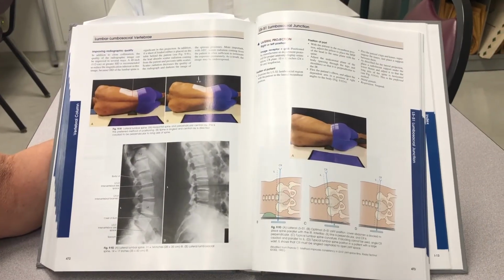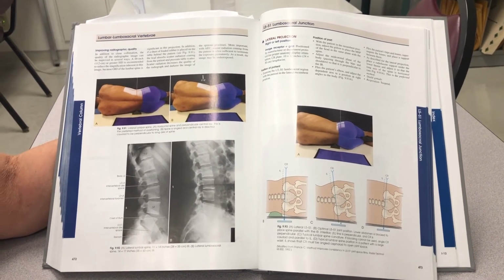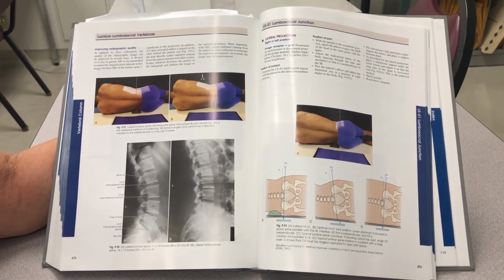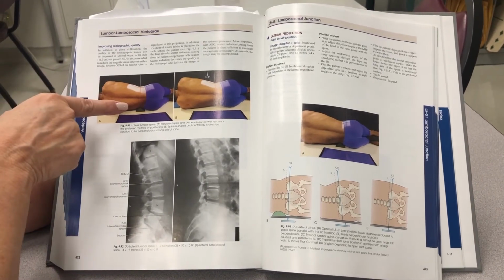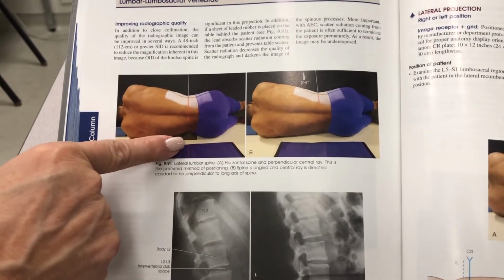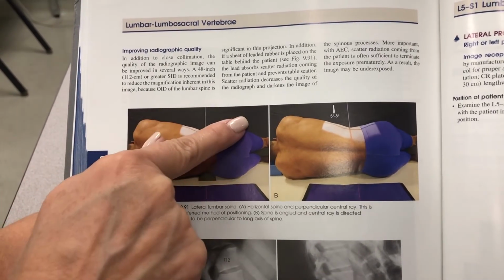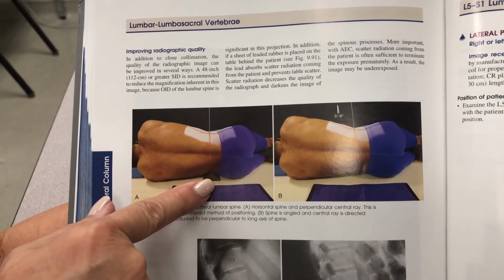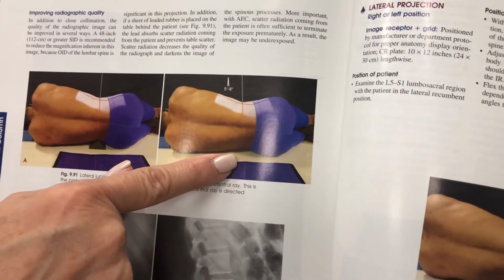Okay, so when I was positioning for the lateral lumbar and the L5 S1 spot, I thought it would be better just to go over this part in your book. So on the lateral, you'll notice that they shot perpendicular when they placed a sponge. Now, on a patient that has a definite waistline, like you see this curved in, you either should put a small sponge at their waist, or you're going to angle 5 to 8 degrees caudad.